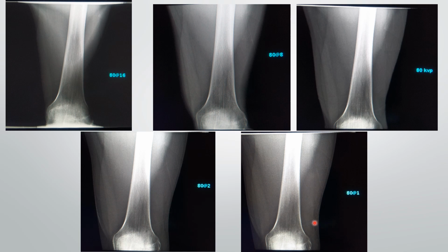So here at 1, we can really see the skin tissue in here, right? But there's not so many rays that are penetrating this area. Okay, the quantity of the rays that are penetrating this area here is lessened, right? So we're losing possibly some detail, especially in here, right?